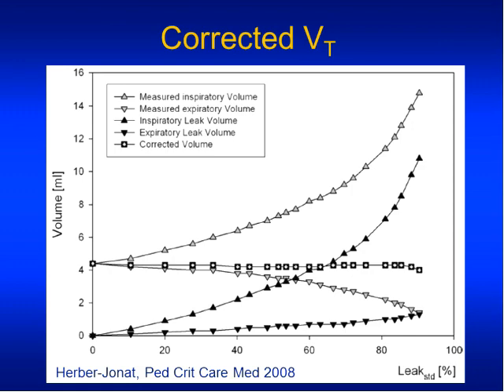And the last thing I will say is that with the new VN500, we now have a ventilator that has very effective leak compensation. With the older models and with some of the other volume-targeted ventilators, you have a big problem when you have a significant leak around the endotracheal tube, and the leak tends to get bigger as the baby gets older.